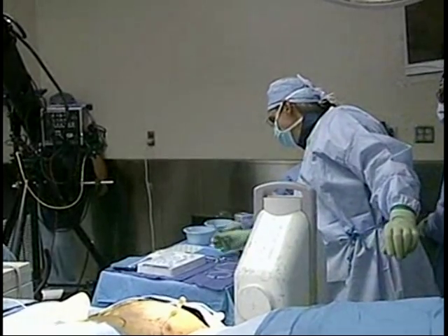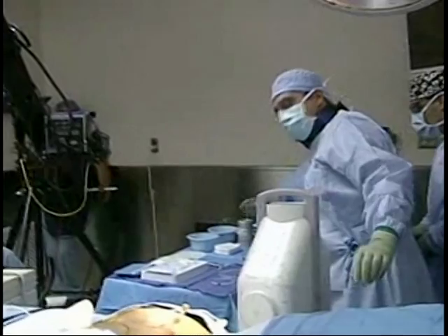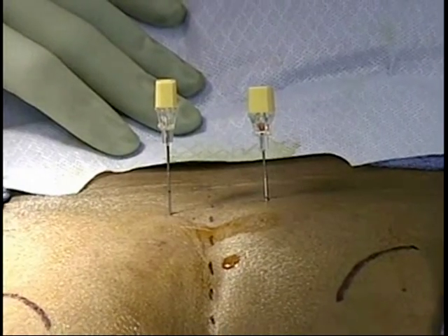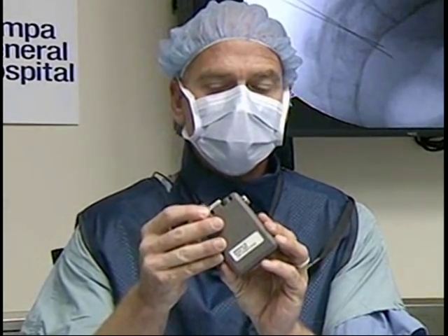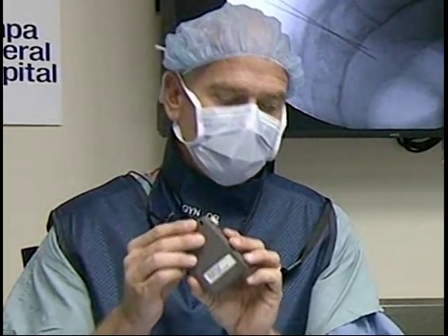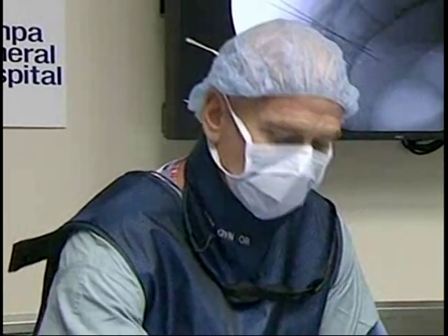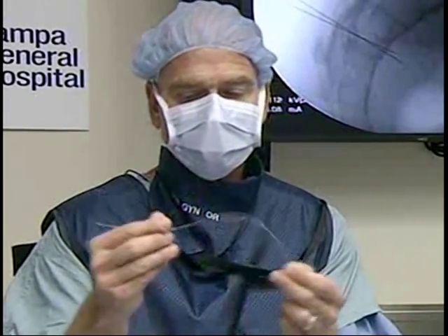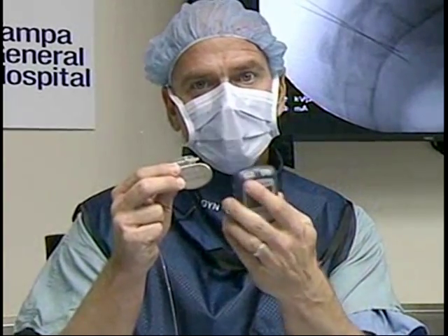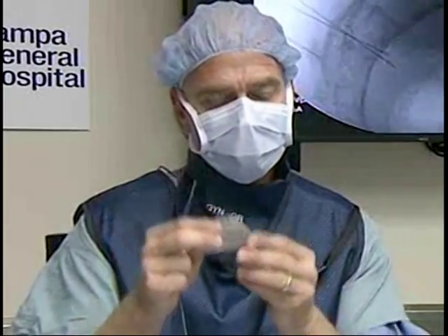Once you've had the test implant done, you'll have this external box and be able to change the stimulation to see what kind of best response you get. You keep a logbook to document how much and when you're voiding, then come back to the urologist who will review the logbook and determine if you're a candidate. Once they determine you're a candidate, they put in the permanent lead below the skin. That connects to a small internal device with a remote control to adjust it up and down. There are several programs so the urologist can change the settings on the actual implant to get the best results.